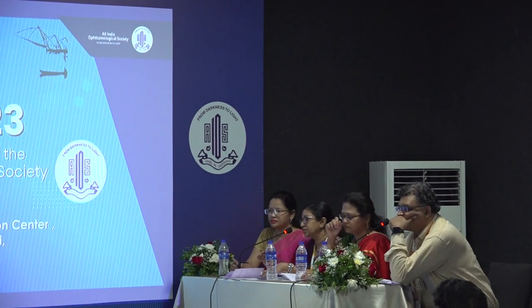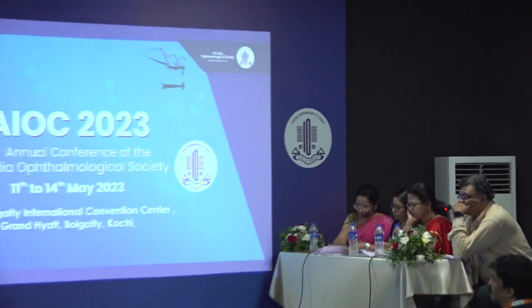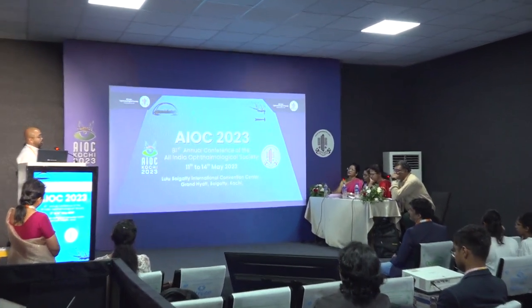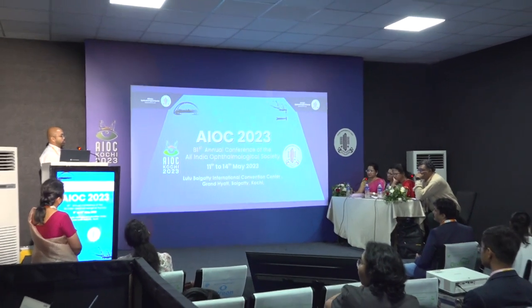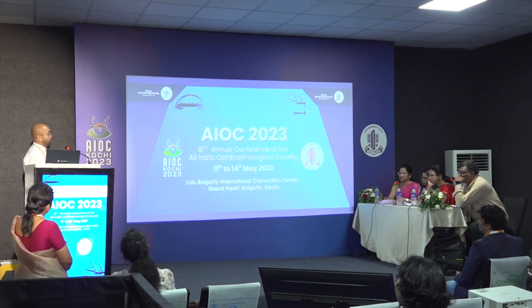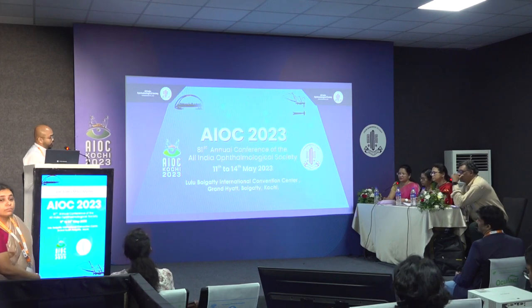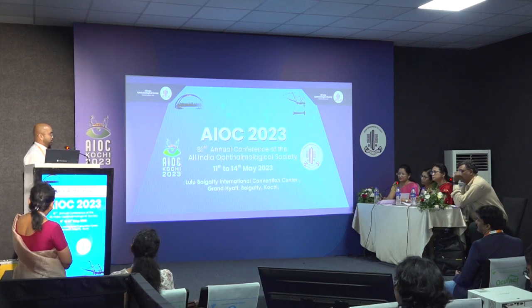And what about the cost? What about the optical? If it is in the central area, will it clear up? No, ma'am. The purpose of this surgery is totally for tectonic purpose. Because at the time of the COVID pandemic situation, we were running out of cornea. So we were looking for some other structure that we can use, especially for descemetocele and corneal perforation. So here we used this umbilical cord for tectonic purpose.